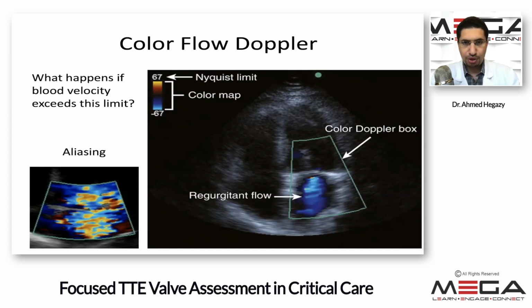So say, for example, you're looking at a wheel as the train is starting to take off, or as the vehicle is starting to move. You look at the wheel and the wheel is turning in a certain direction until the speed picks up. And once the speed is really fast, the wheel starts looking to you like it's going backwards. The reason for that is the shutter speed of your eyes is slower than the movement of the wheel. And so because your shutter speed is slower, you start seeing the wheel move backwards. You're not accurately detecting where it's moving just because your shutter speed is too slow.